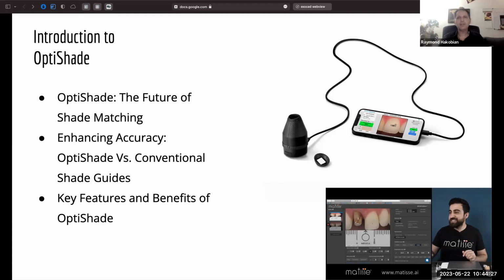All right. Actually, I brought it to show you guys. It usually has a cap on the top. When you connect it to your phone, you should turn it on. When you turn it on, you have to calibrate it for each time of use. Let me show you. This is the cone camera, and this is a cap.